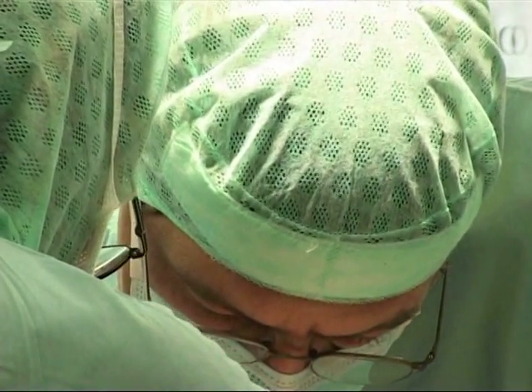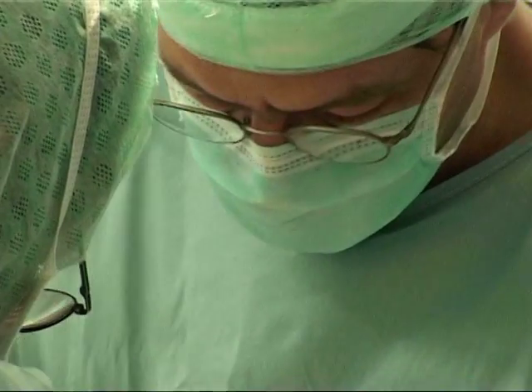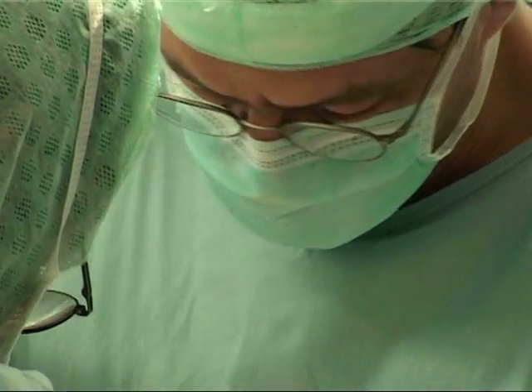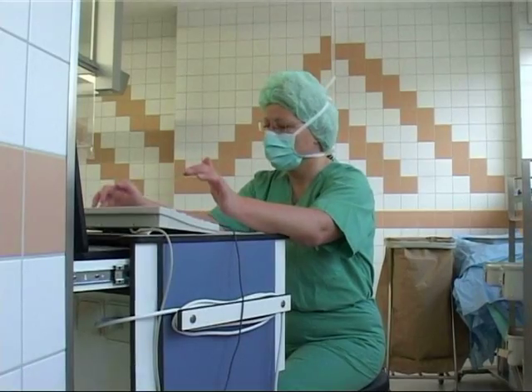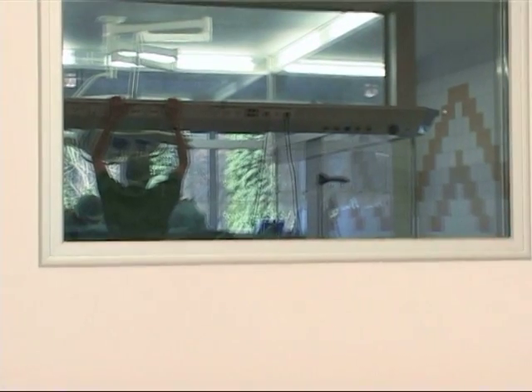After having drilled the channel, we insert the prosthesis from the front. The prosthesis itself has a rough surface so that the bone will grow over the surface of the implant. This occurs within the first six to eight weeks after surgery.